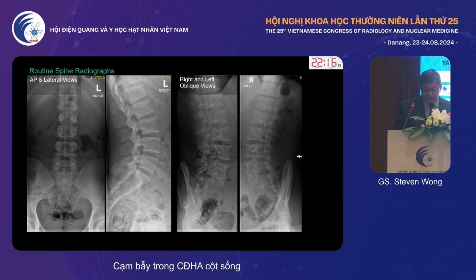The coronals also help you look for places where there's muscular trauma in the paravertebral and paraspinal muscles. Always look at the routine x-rays at the same time as you look at the MRI. If they are obliques, even better. Oblique x-rays are very helpful when you want to look at places like the posterior lateral corners and when you want to look for Pars defect.